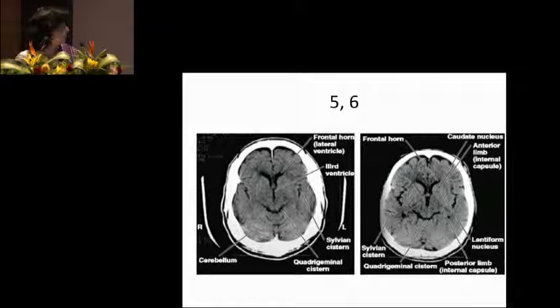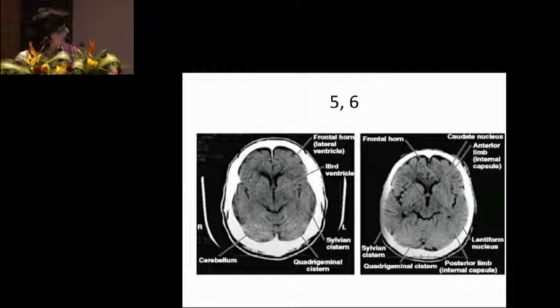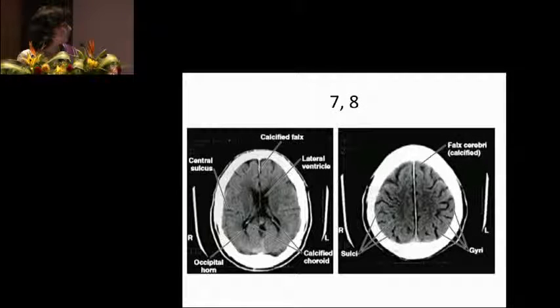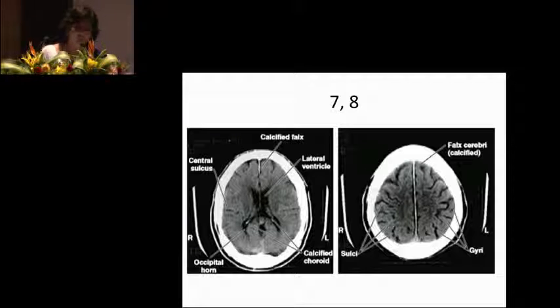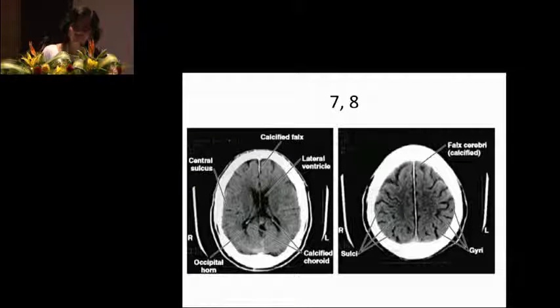Higher up is the midbrain level, where you start seeing the frontal horn of the lateral ventricles and the third ventricle has appeared. Coming to the basal ganglia level, you see the nuclei — the caudate, the lentiform — and the internal capsule as well. Moving further up, you're able to see the lateral ventricles much better, and at the vertex, this is the place where you look at the sulci and gyri, especially in elderly patients, to find out if the loss of volume is physiological or pathological. In an elderly patient, the sulci here will be much larger.